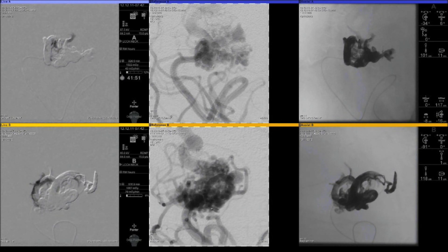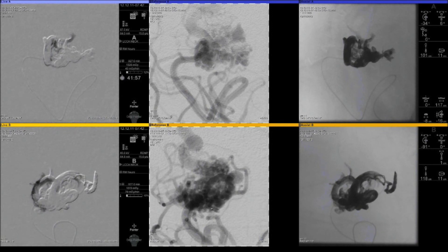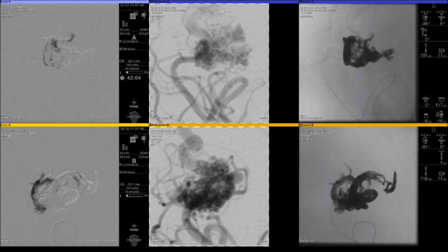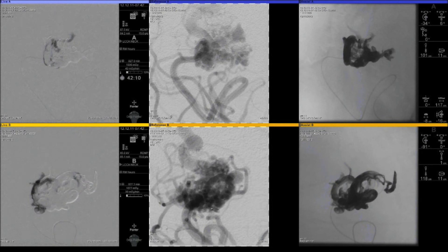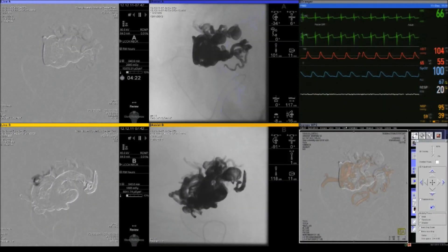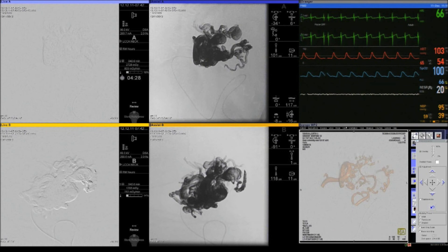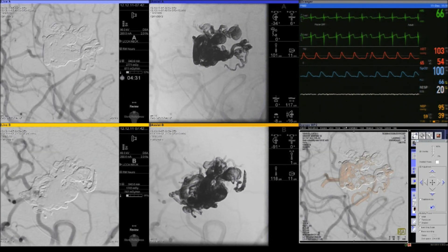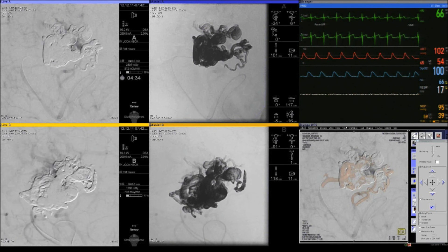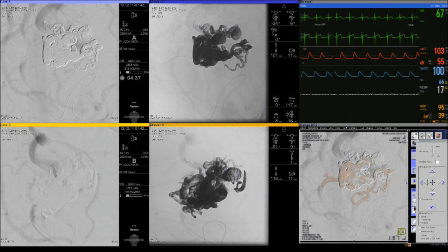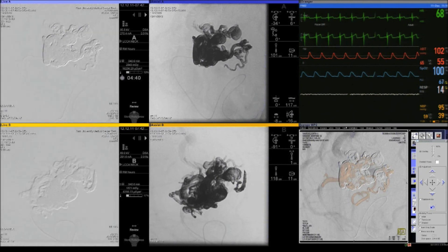An important aspect is that you must keep your microcatheter inside the Onyx cast. If you remove the microcatheter from the cast, there is a good chance the material will polymerize inside it. Keeping the microcatheter within the cast without pulling back during embolization is very important. It is also important not to wait more than 2 minutes, as the material could solidify inside the microcatheter. One advantage of Onyx is that you can perform angiograms during embolization to assess the degree of occlusion.